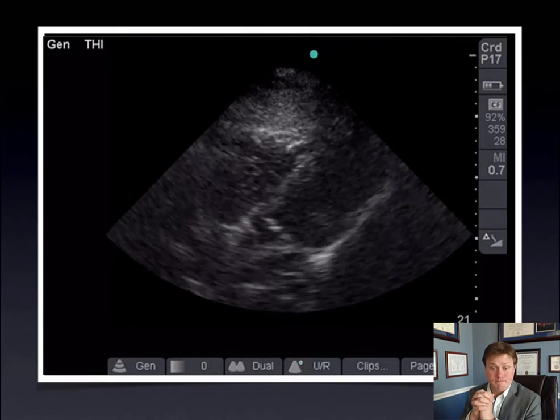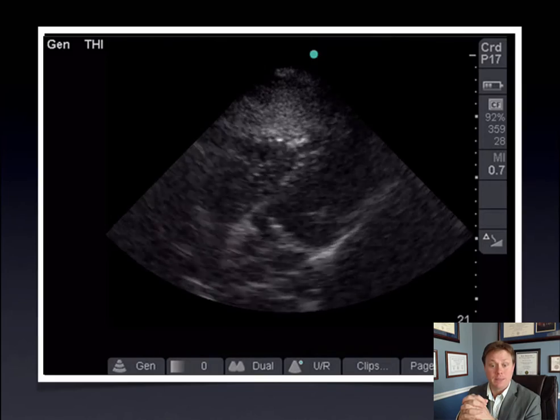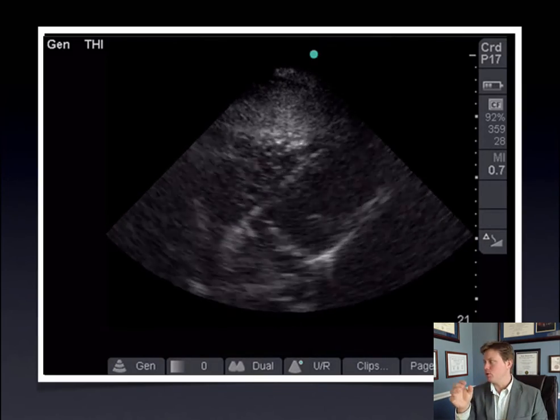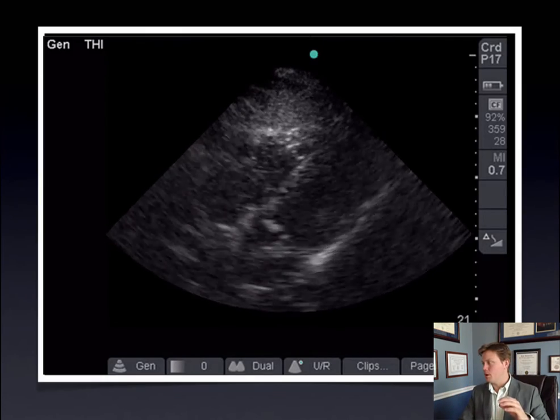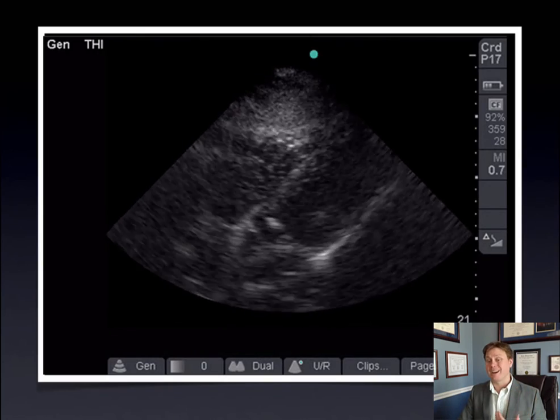Not a lot of anything, right? So this is cardiac standstill that's being taken in between compressions during a pulse check. Now you can see something happen. You can see some blood moving in the right ventricular chamber. You might even be able to see a little flicker of the mitral valve, but none of the cardiac muscle itself is moving.